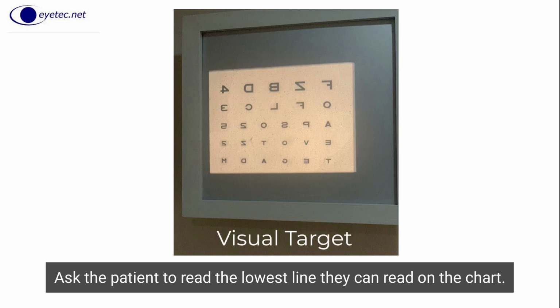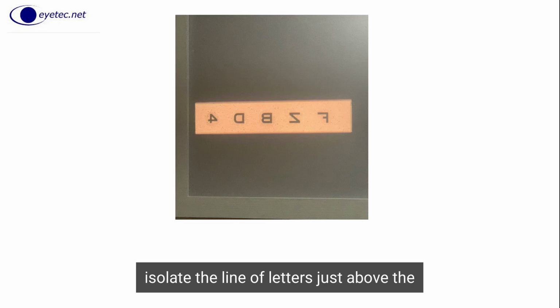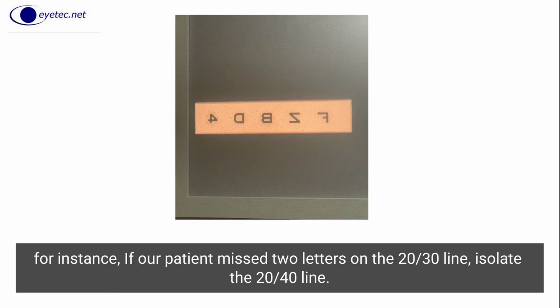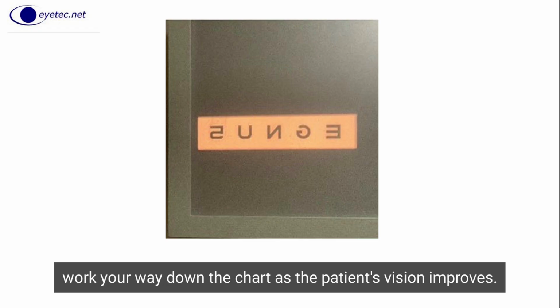Ask the patient to read the lowest line they can read on the chart. Using the projector controls, isolate the line of letters just above the line that the patient had a little trouble reading. For instance, if our patient missed 2 letters on the 20/30 line, isolate the 20/40 line. As you proceed with your refraction, work your way down the chart as the patient's vision improves.